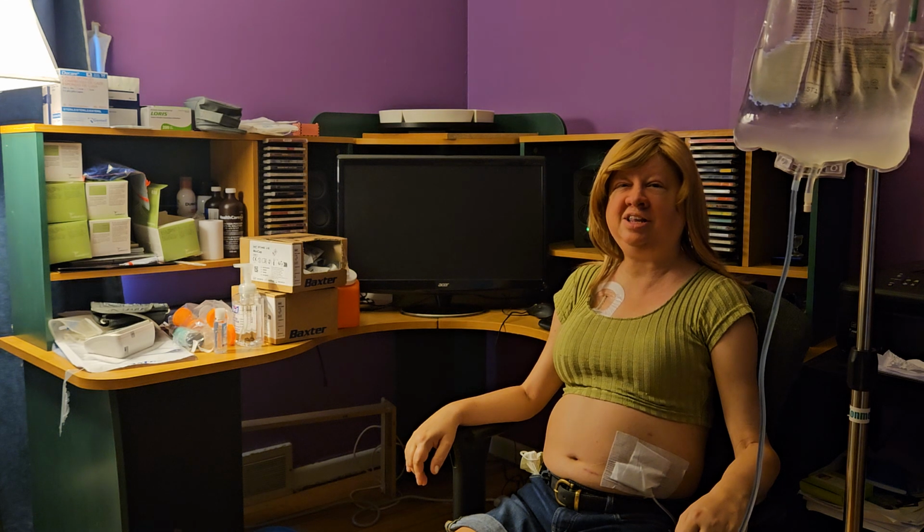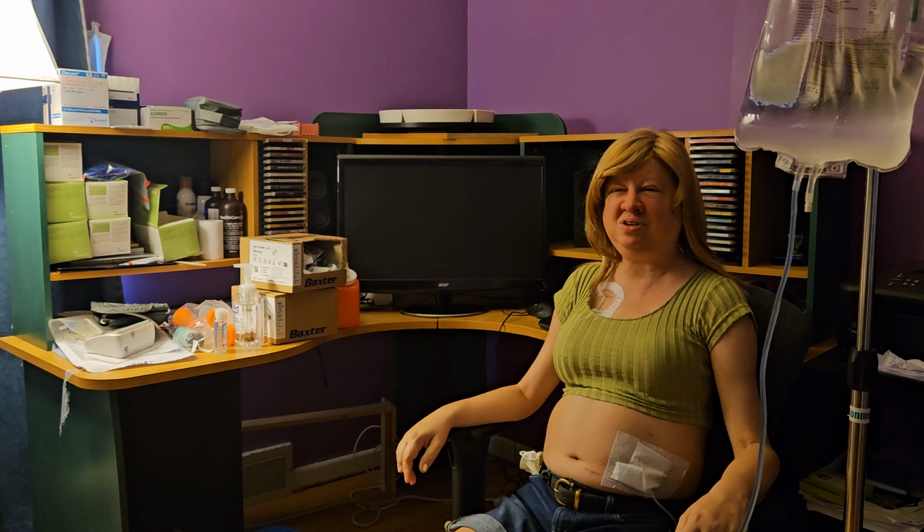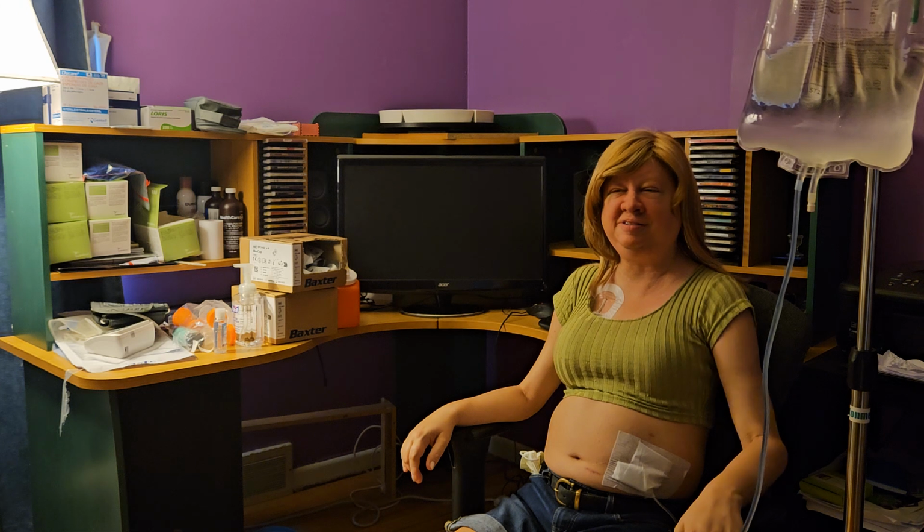Right now I do this during the day, but hopefully if it all works, I can do this at night instead. And then you can just detach during the day and not have to do this at all. So it would be only overnight while you're sleeping. You wouldn't even notice the fluids going in and out, supposedly.